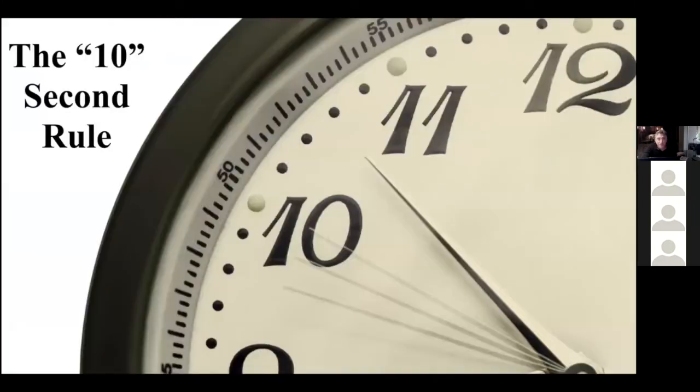The 10-second rule. If you tune out after this slide and the next, you still are going to come away with some good stuff. This is the whole enchilada right here. Here's what it means. You're going to learn in this seminar that when we take teeth out, we lean on the tooth with an elevator. And you live in a day and an age different than 15 years ago when we only had a set of 4 elevators for most surgeons. Well, today you have a whole new array of shapes and sizes.